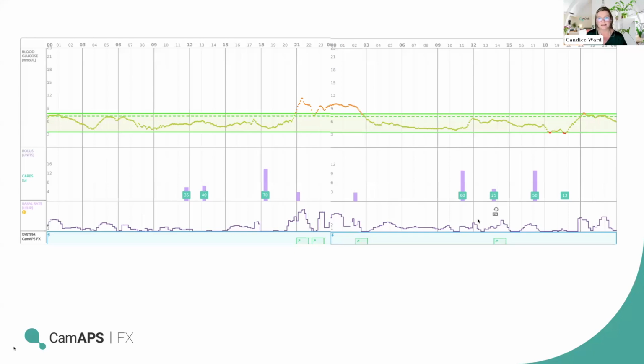But I mean, we're fine-tuning perfection here, just looking for those signs of when the ratio is too strong, when the ratio is too weak, and whether there are signs of pump maintenance that we need to be so careful about. We think it's a very sophisticated algorithm, but if people are forgetting to bolus, or they're forgetting to do regular set changes with the right cannulas, and encouraging our women as the pregnancy progresses to do more set changes so that the insulin absorption and delivery is as equal as possible, is really helpful throughout the pregnancy. Sophisticated algorithm, but it's not going to help if the set isn't working well.